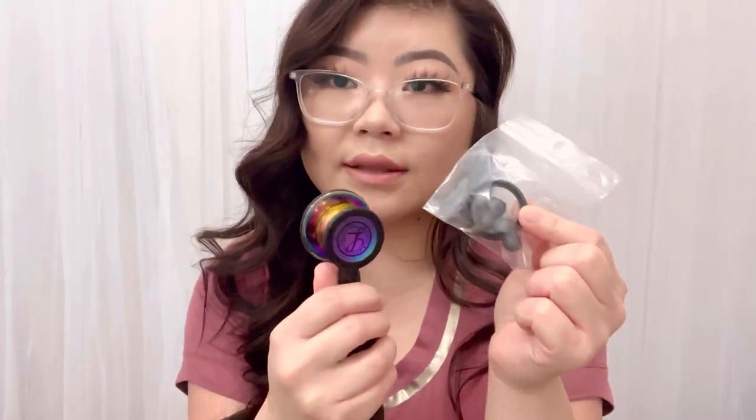It also comes with a new set of earpieces and a little ring, I think for the bell part of the stethoscope. I think you can replace it if you need to.